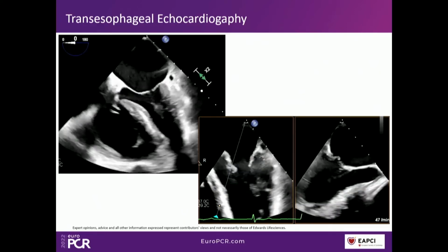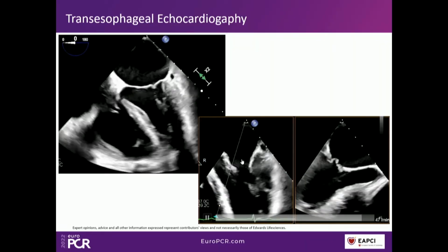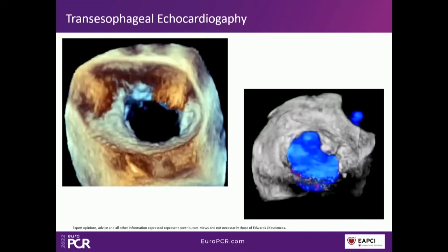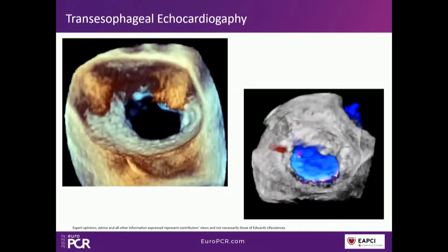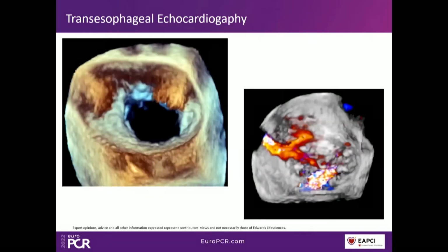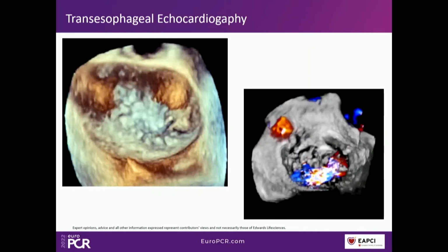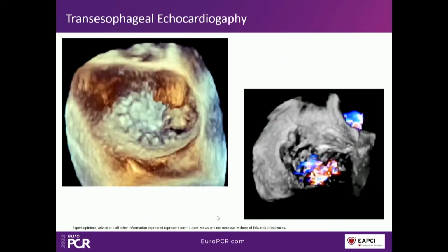So obviously here something is not quite right, and you can also see that this refers to more the medial aspect of the mitral valve. This is a 3D image, obviously. You can see a severe mitral regurgitation, and this is due to a medial commissural pathology. And I phrased it quite vaguely because it could be interpreted in different ways, but it's commissural, and there is a pathology.